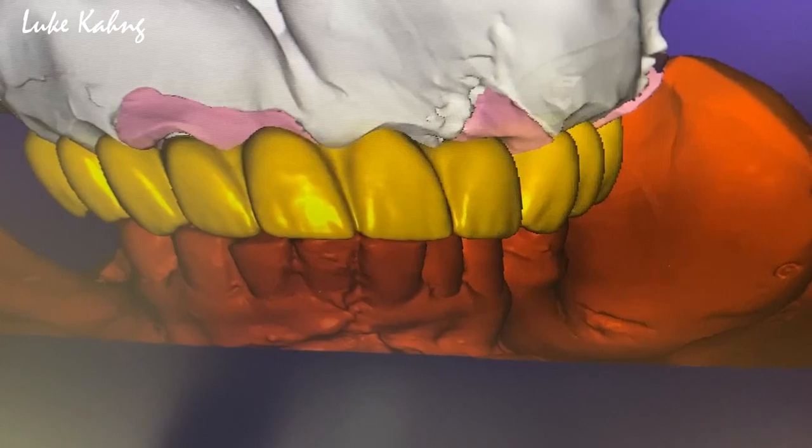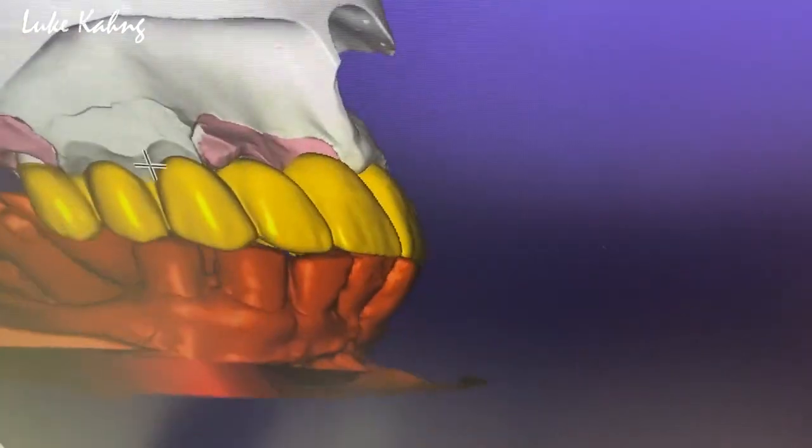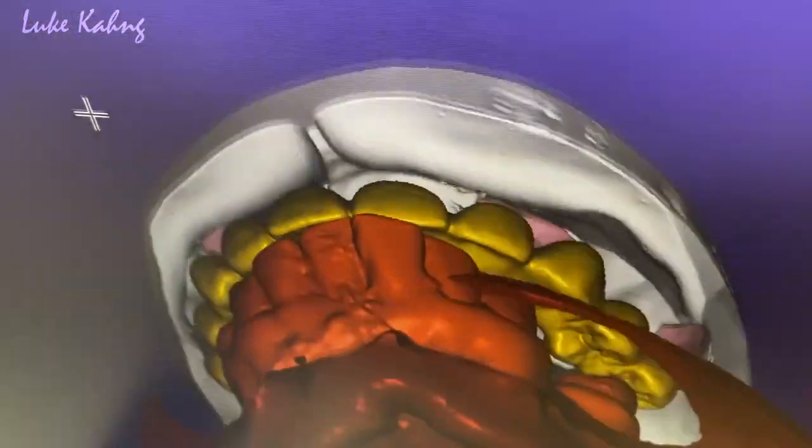Side view, occlusion view, and then occlusion view without opposing model.